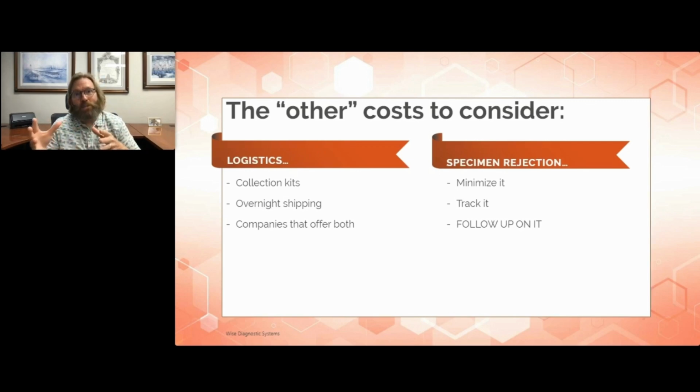The other thing we were able to do is address one of the more common issues we had. People wouldn't know that there was fluid in there, because you can't really see that there's a whole lot in there, so it would spill out, or they would pour it out, not understanding that it should stay in there. We actually added a big highlighted sticker when you open the kit: do not pour out liquid, liquid must remain with the tube. That has reduced it somewhat on the patient collection side of things.